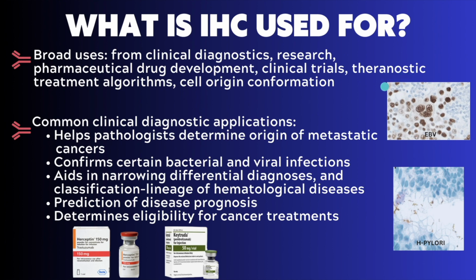The top photo shows a slice of a patient's lymph node that has been stained with Epstein-Barr virus antibody, or EBV. The Epstein-Barr virus is commonly passed by teens in the form of mononucleosis and has been known to linger in the body for decades. Later in life, this virus can cause more complex diseases, such as lymphoma and multiple sclerosis.